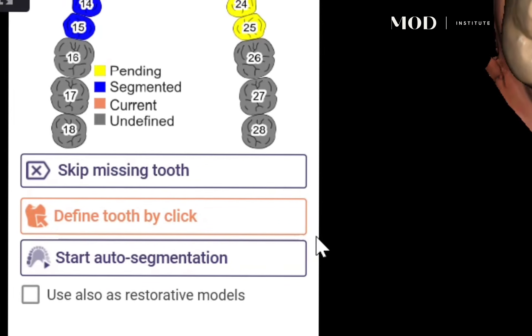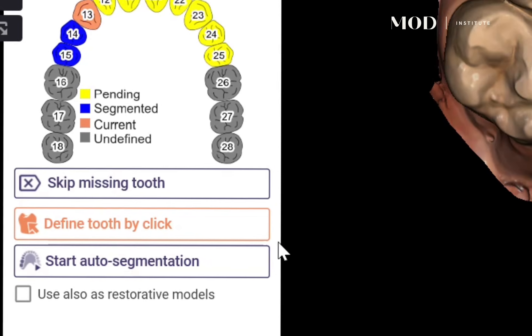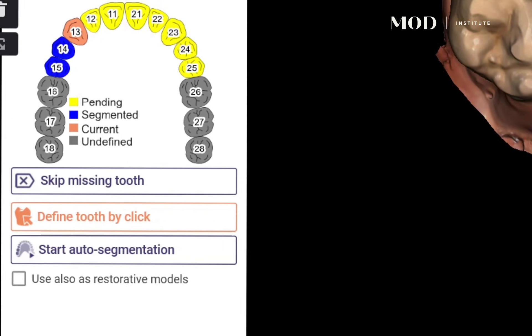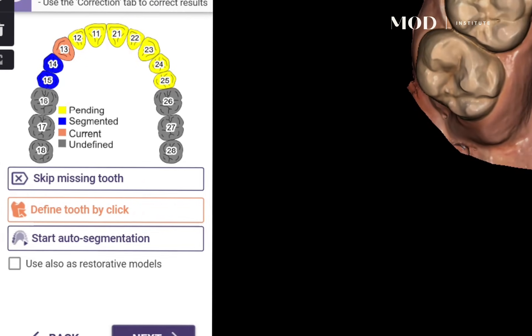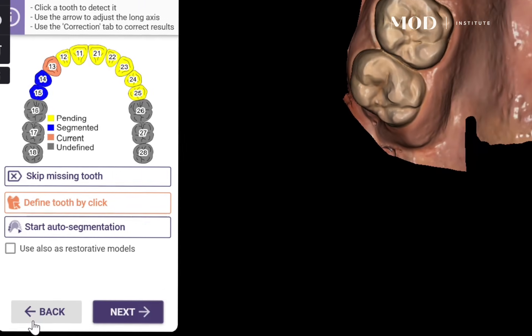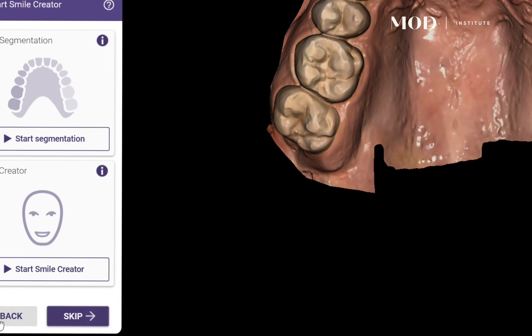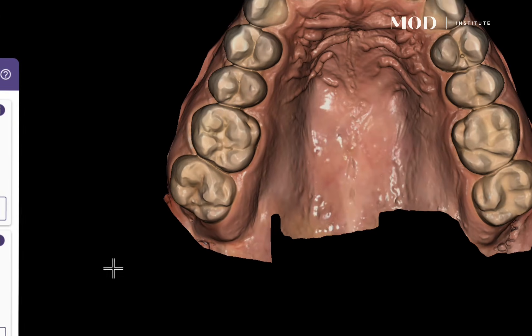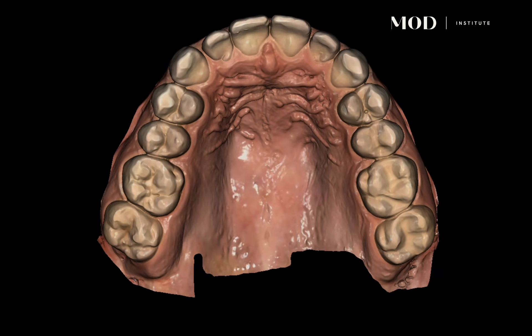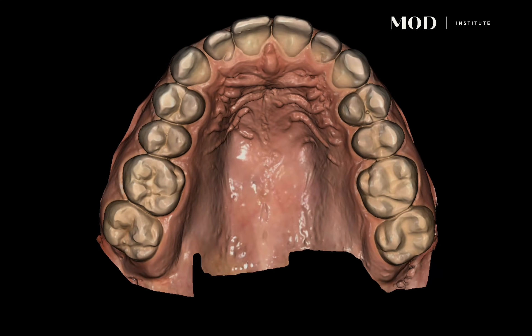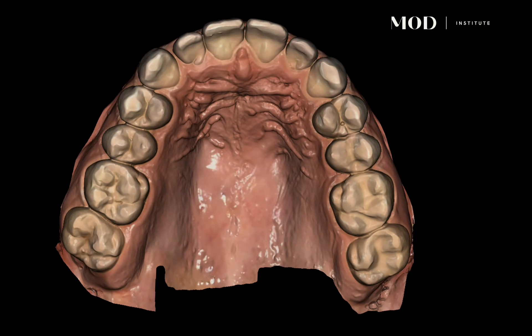Auto segmentation is going to take it through an AI cloud-based algorithm where it's going to identify the actual teeth in the arch that you want to use, separate those teeth out, and make library teeth out of those.